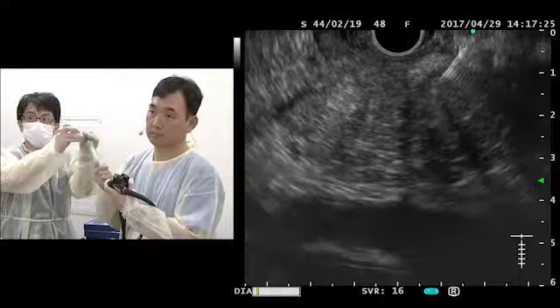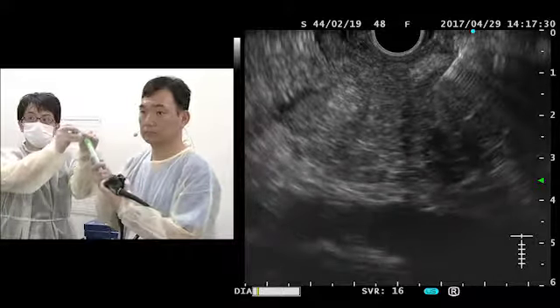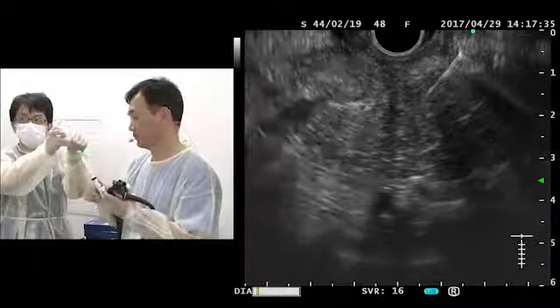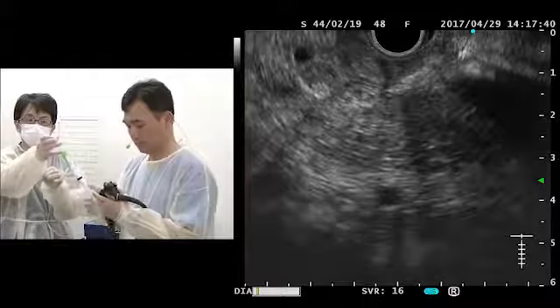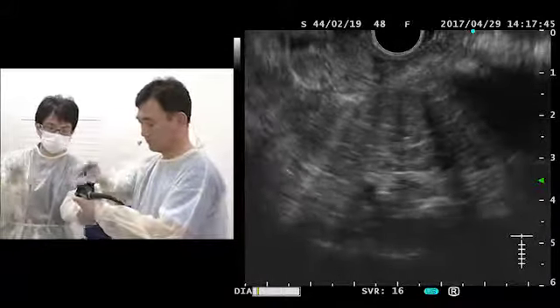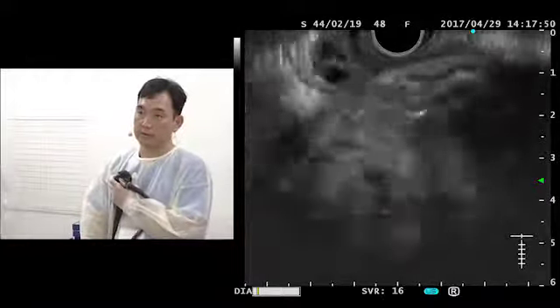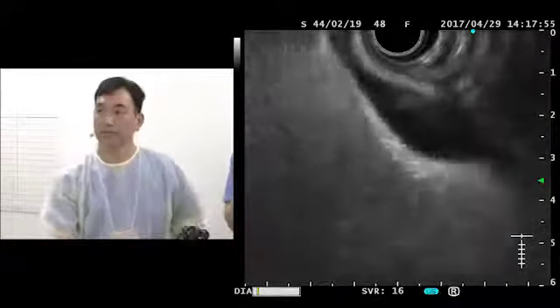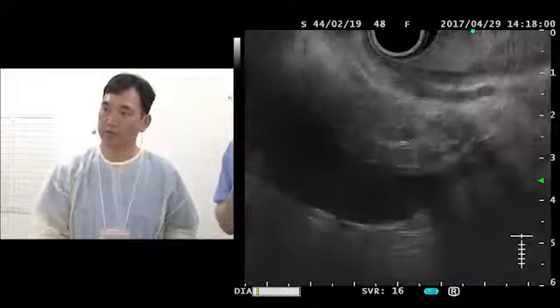Because we saw these cystic lesions in the duodenal wall, the pancreatic duct is dilated but not abnormal. There is only some abnormal tissue in the head of the pancreas. Also the bile duct was not like Caroli. Yeah, the bile duct actually connects nicely into the ampulla, and on the imaging studies, we did not see the pancreas wrapping around the duodenum.